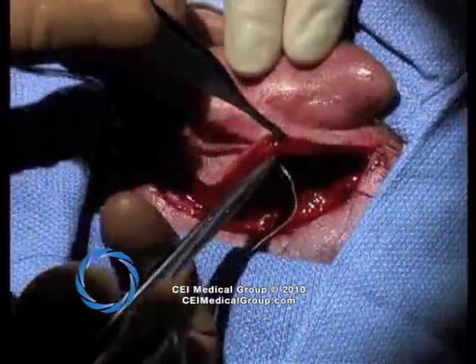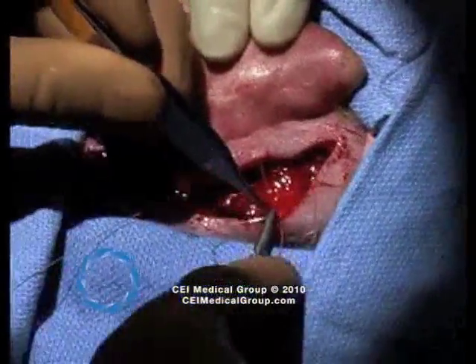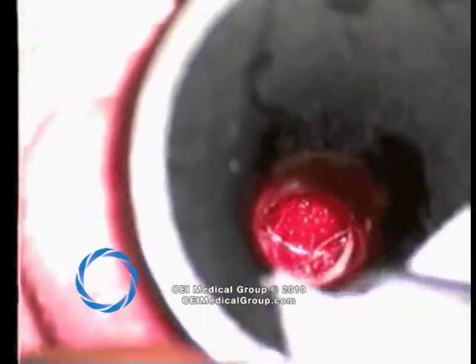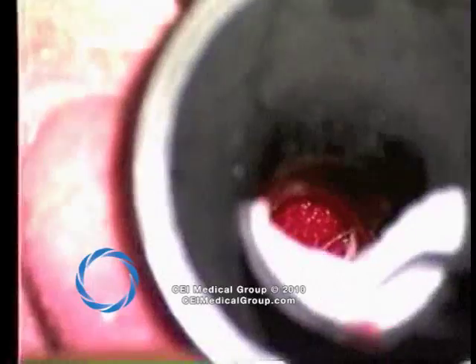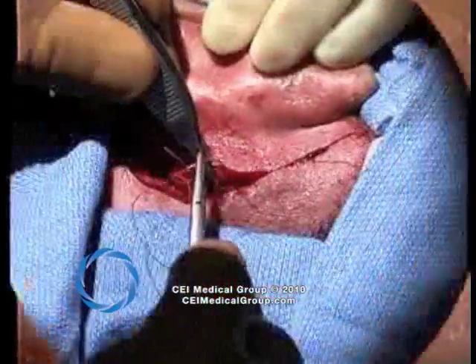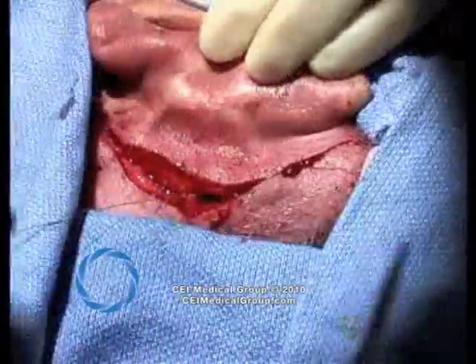The ear is then released from the retractor and hemostasis is achieved, with a tacking suture placed posteriorly. The surgeon then returns to the external auditory canal, unfurling the lateral flaps and filling the canal with antibiotic-containing gel foam. The posterior wound is closed in the usual fashion with interrupted subcuticular sutures and steristrips are applied.